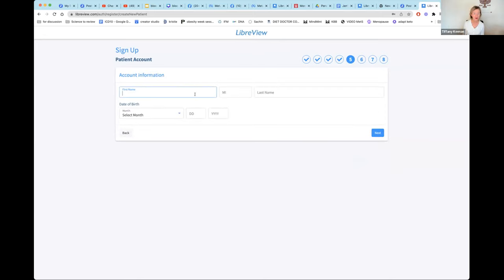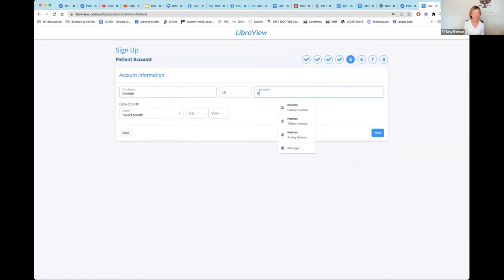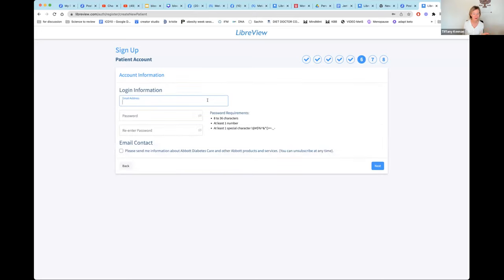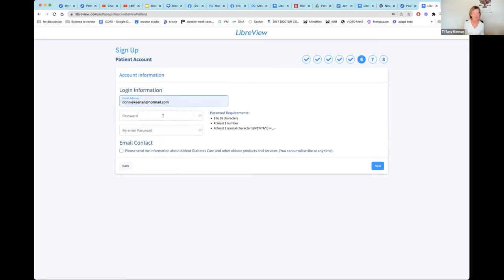Then you set up your account name. I'll try setting up my father's account. You pick a birthday, enter your email address, and set up a password just like you would with any account, then hit the Next button.